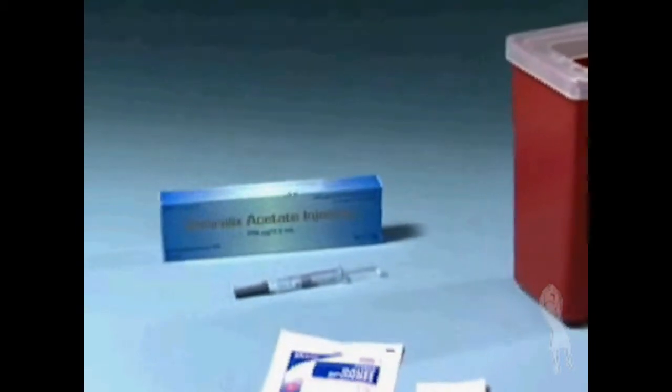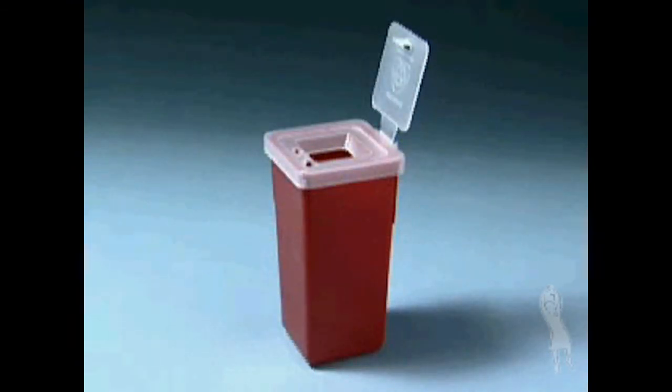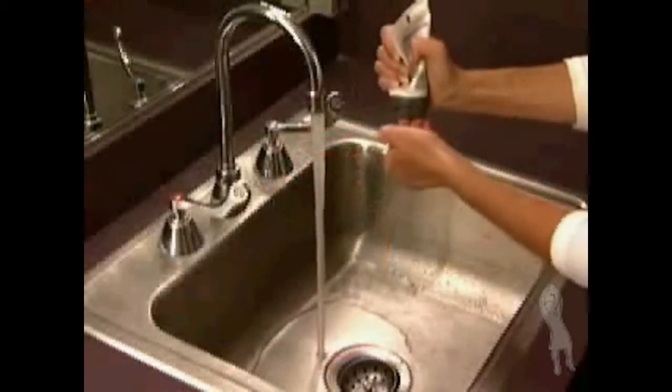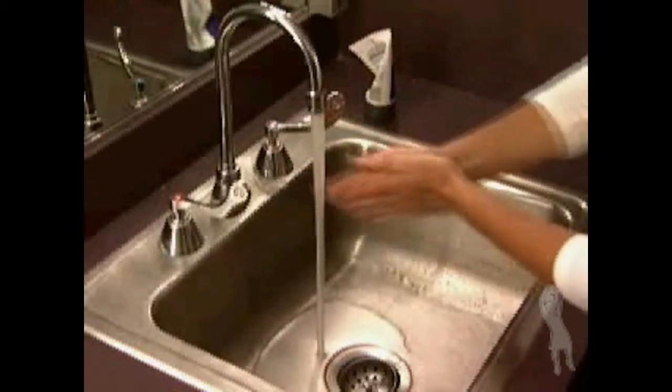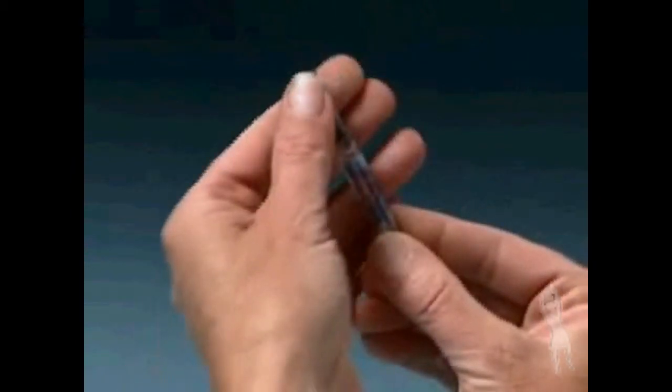Be sure to have all the following items before you begin: Ganirelix acetate injection prefilled syringe, alcohol swabs, sterile gauze, and safety container. Wash your hands with soap and water and make sure you're working on a clean flat surface.